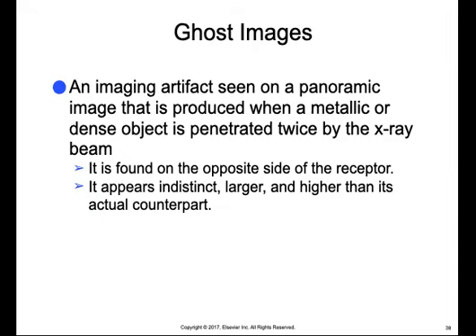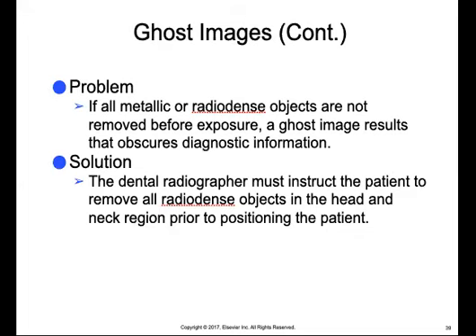So what causes a ghost image is failure to remove radiodense objects like earrings, dentures, hearing aids, or piercings, or other objects like that. The problem occurs, like I said, when these radiodense objects are not removed. And the solution is, as the dental radiographer, you must instruct the patient to remove all radiodense objects in the head and neck region prior to positioning the patient.